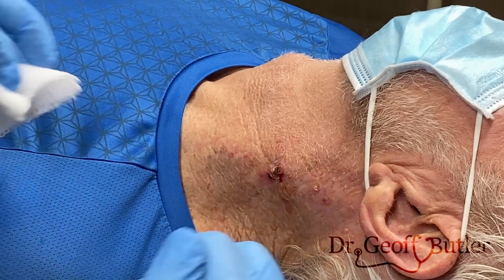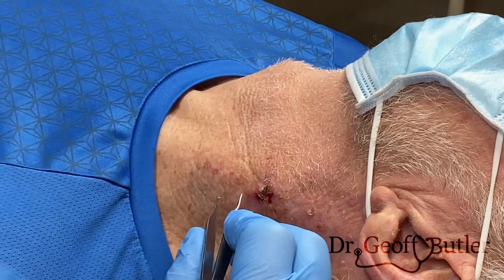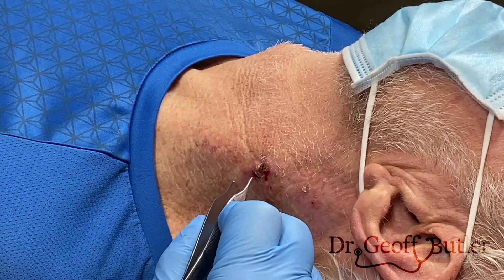This patient is coming in for removal of a lesion on the left side of his neck. He's had a lot of sun exposure, and we've already done a number of cases where he's had squamous cell cancers and basal cell cancers.